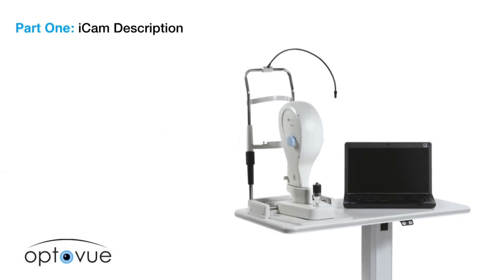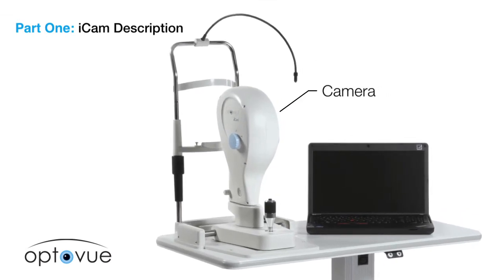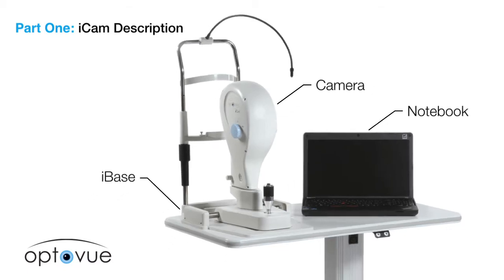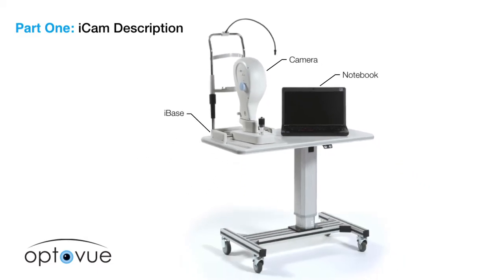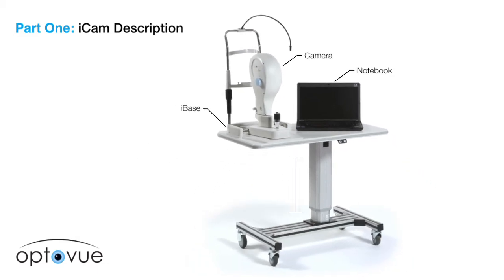Part 1: Features. The camera sits on the joystick mount and chin rest assembly referred to as the iBase. The iCam is connected to the computer, a power supply, and the iBase. It should be mounted on a table capable of raising and lowering.